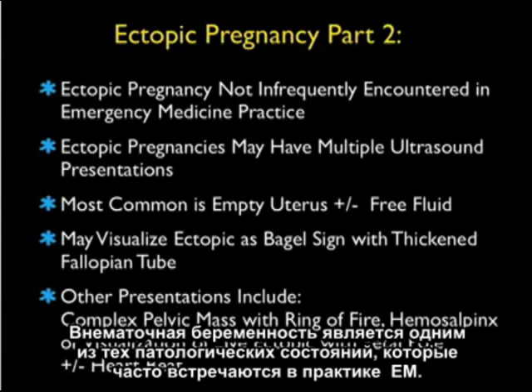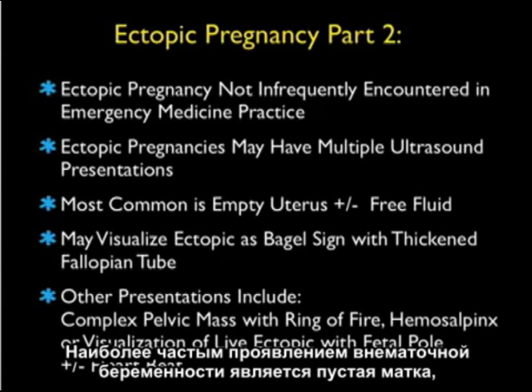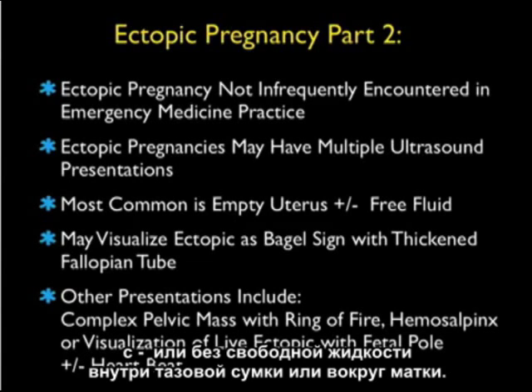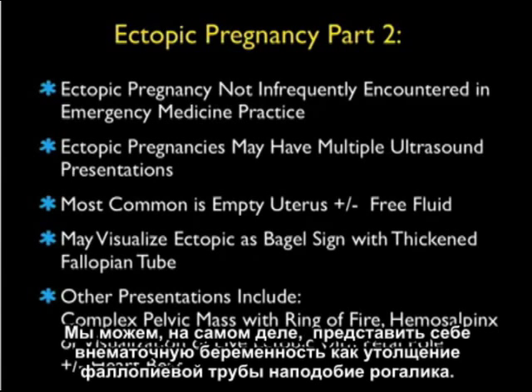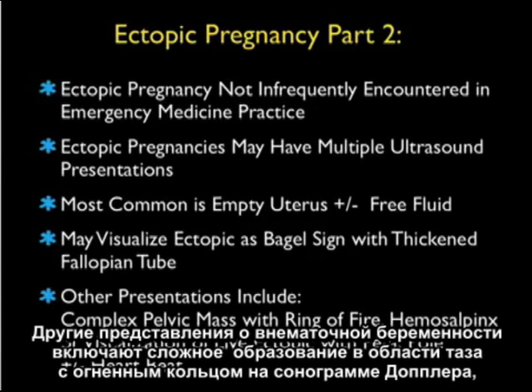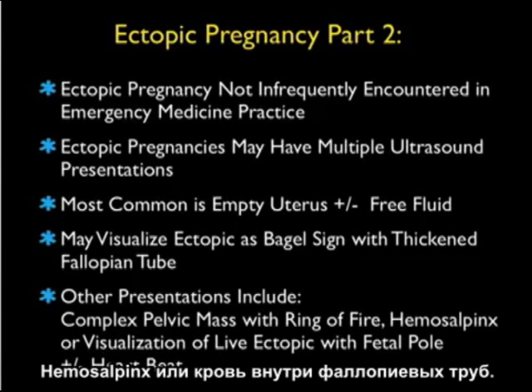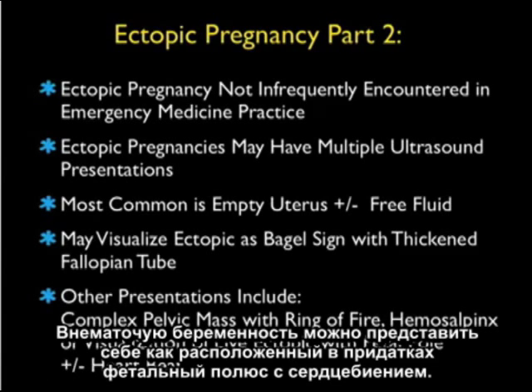Ectopic pregnancy is one of those conditions we'll not infrequently encounter in a busy EM practice. The most common presentation will be an empty uterus with or without free fluid within the pelvic cul-de-sac or surrounding the uterus. We may be able to visualize the ectopic as a bagel sign, which constitutes a thickened fallopian tube. Other presentations include a complex pelvic mass with a ring of fire on Doppler sonography, hemosalpinx or blood within the fallopian tube, or we may actually visualize a live ectopic in the adnexa with a fetal pole and/or heartbeat.